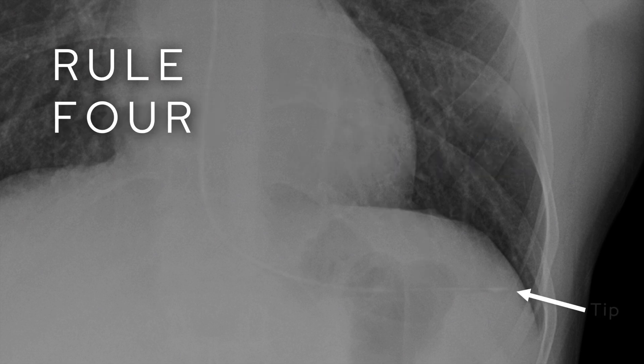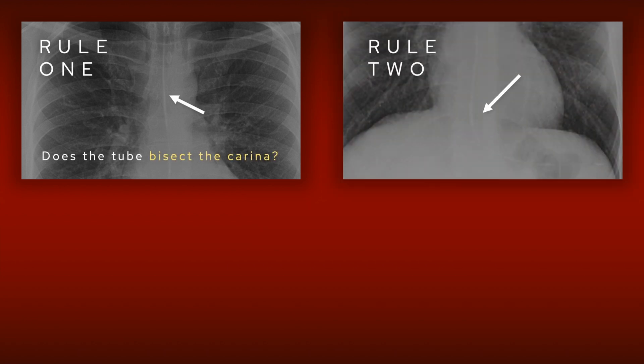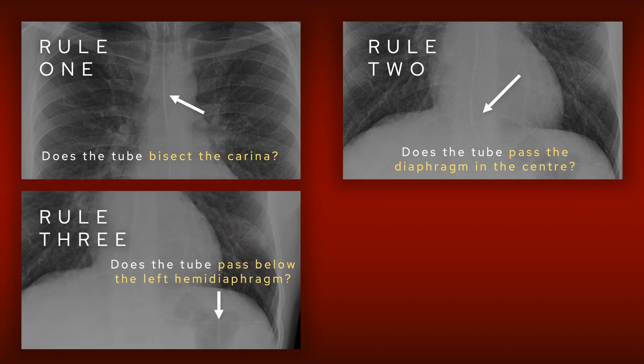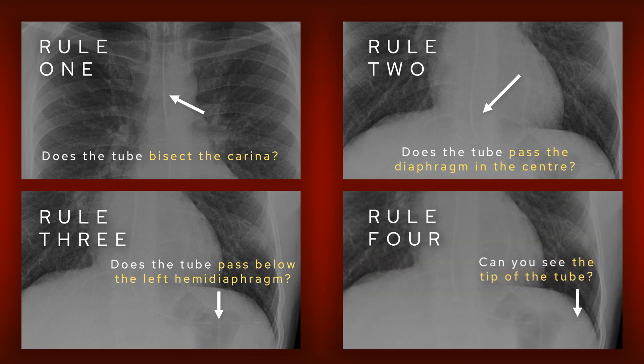If you satisfy those three rules you're on pretty safe territory, but to be absolutely sure you want to see the tip of the tube in the left upper quadrant of the abdomen. To recap: firstly, make sure that the tube bisects the carina; then follow it down — does it pass the diaphragm in the center; then does it go into the left upper quadrant of the abdomen; then can you see the tip of the tube? If you've satisfied all of these things, you can be fairly certain that the tube is in the right place and you can start feeding the patient.